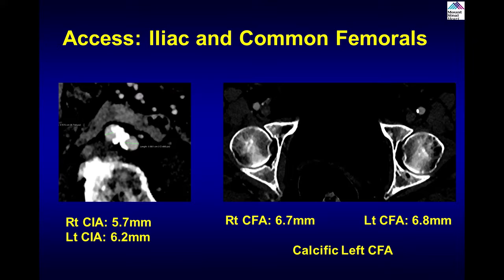And again, there on the left of the screen, you can see at the aortoiliac bifurcation around 6 millimeters, a little bit calcified, a little bit of caution needed, but nothing to be too concerned about. So if you just go to the angiogram now, I'll just take you through the access. Show us the cines, please.